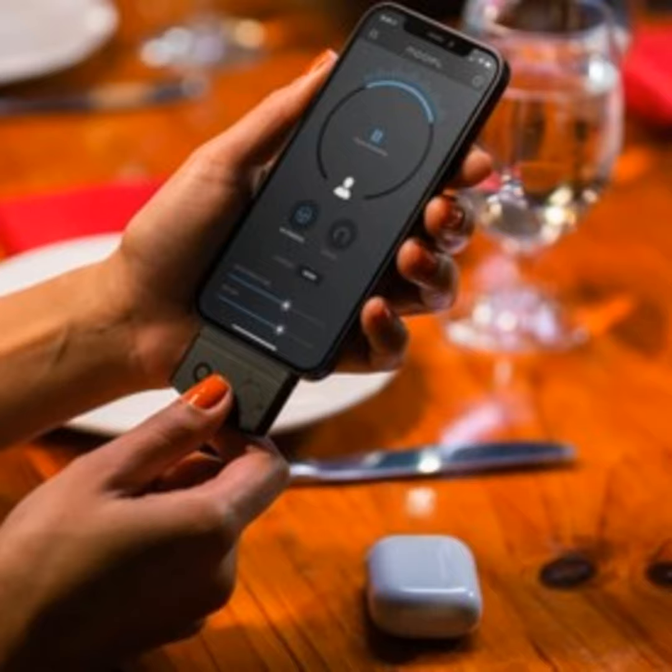The reason that we haven't yet found other headphones or earbuds that work with Noopl is all about latency and Bluetooth specifications. It just takes time for the signal to be streamed from your phone to your earbuds, and that time can affect how you perceive the sound.